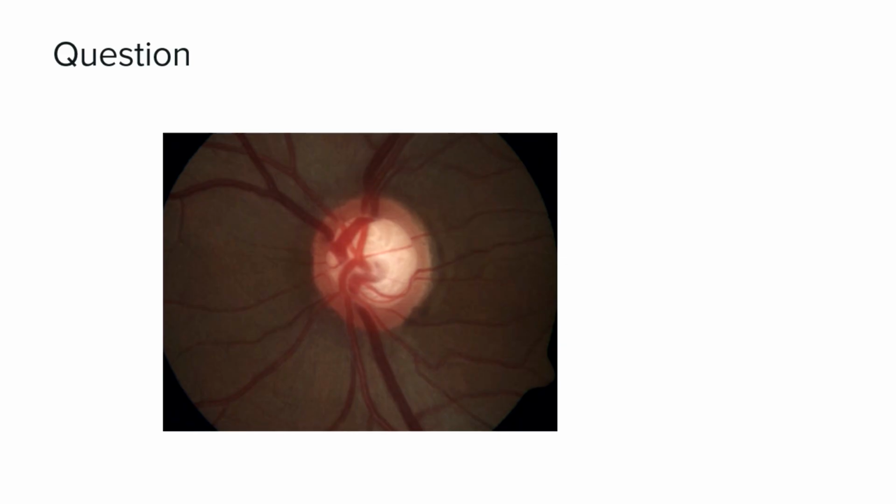How many of you would say glaucomatous? Raise your hands. Okay, no glaucoma. So 1, 2. So the rest of them, what is the diagnosis? Is there anything else? You should come up with the proper answer, right? But again, I want to reiterate that these nasalization, bearing of blood vessels and cup disc ratio are non-specific signs. You cannot pinpoint glaucoma based on that.